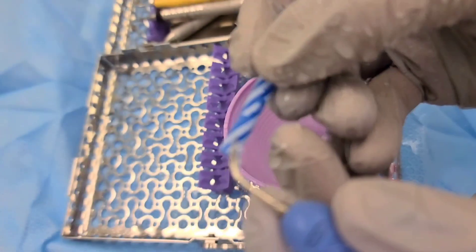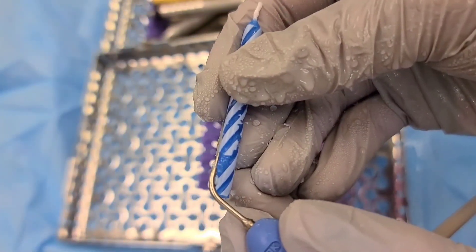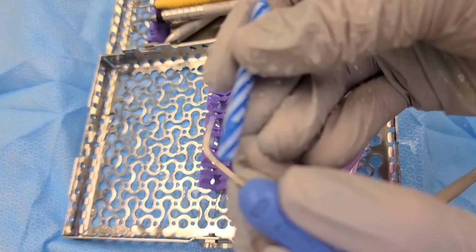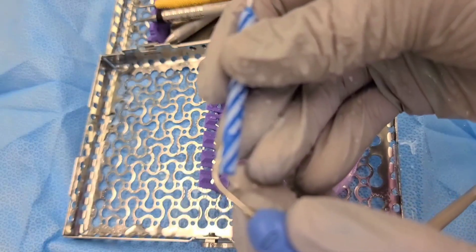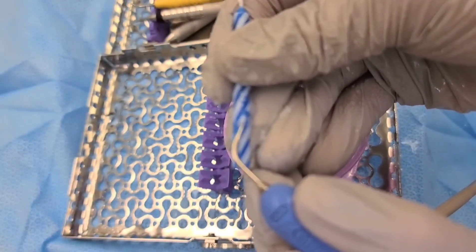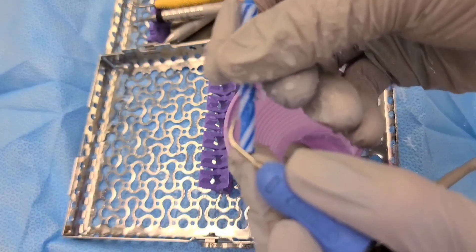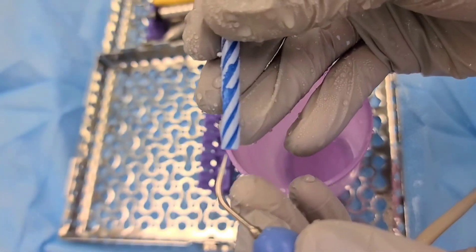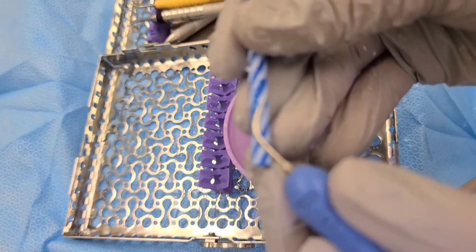Another thing I noticed is that students or first-time users apply way too much pressure, as they would with hand-scaling instruments. This is wrong because magnetostrictive or power-driven instruments are designed to ease the job for you and help with ergonomics — because we're looking at long-term preserving our hands. That is why we want to shift our mindset away from the pressure we'd use in hand-scaling to the much lighter pressure needed when we use ultrasonics.